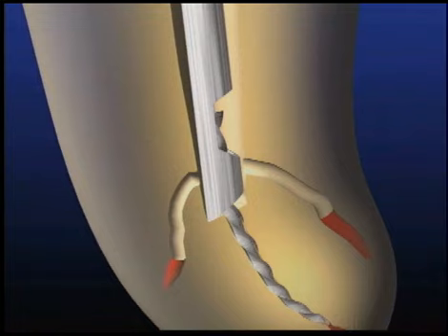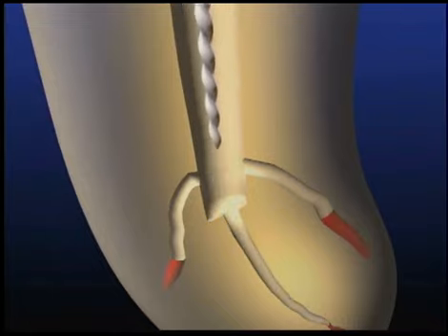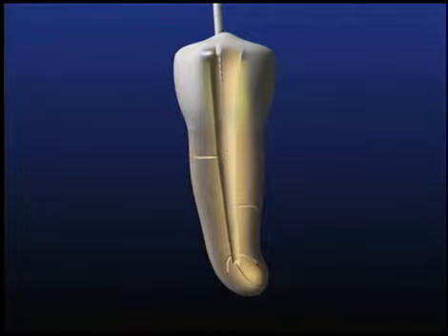When the microtube is fully seated, the screw wedge is introduced by rotating and advancing its handle counterclockwise. The screw wedge then engages and displaces the head of the file out the side window. Now remove the obstruction by rotating the assembly out of the canal.